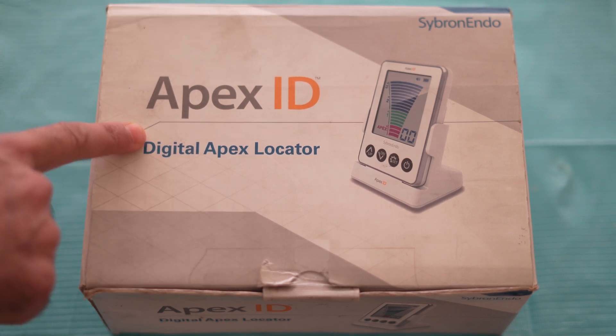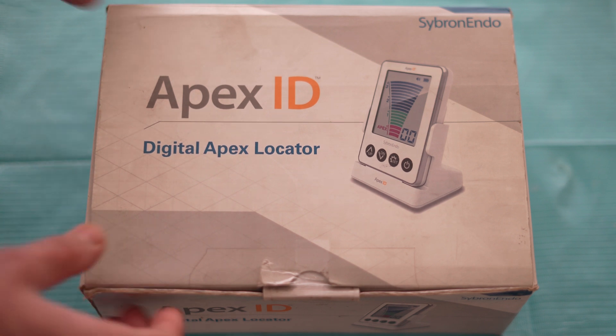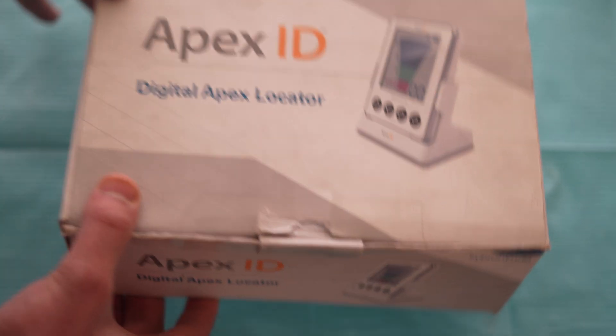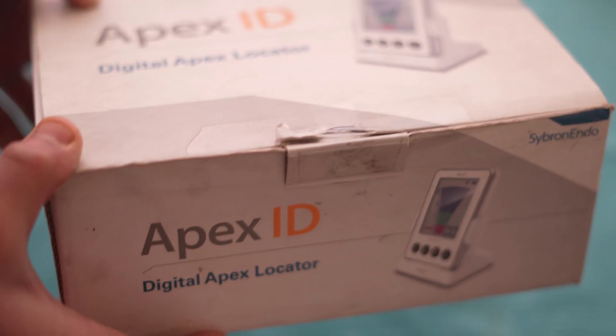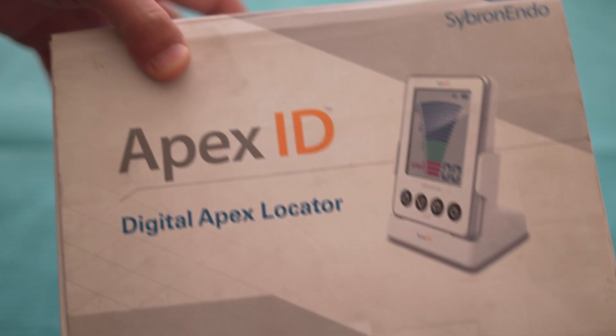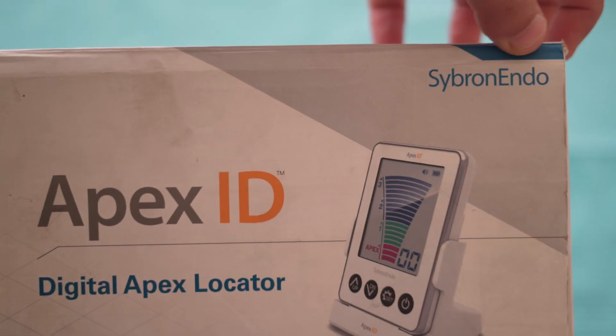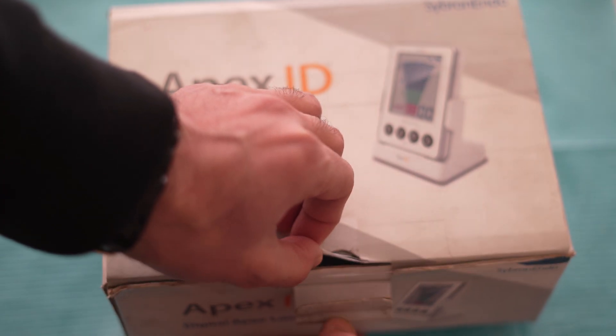Hello friends. Today I will unbox this Apex ID Digital Apex Locator. This is the best Apex locator you can have in your practice for doing root canal treatment. Especially if you are a new dentist, you can have this Apex locator — it will definitely help you in improving and providing excellent endodontic cases. This Apex locator is from SybronEndo. So let's see what's inside it.